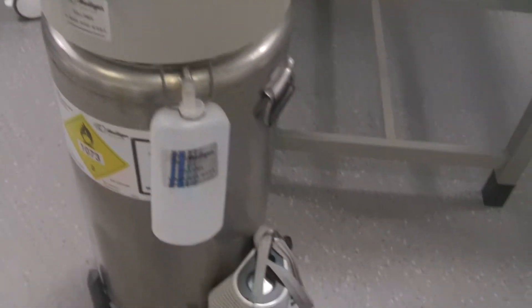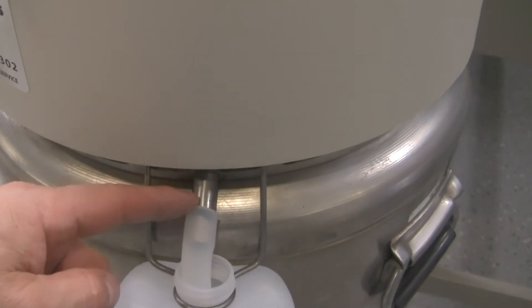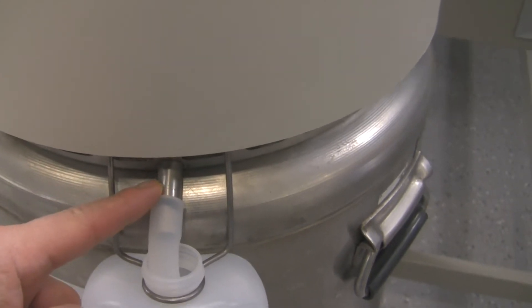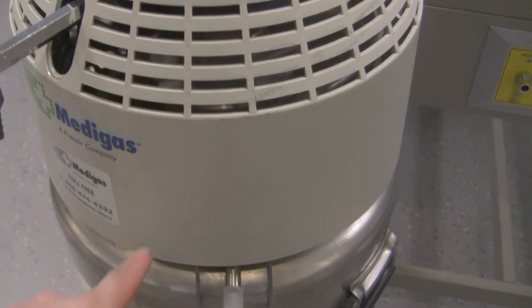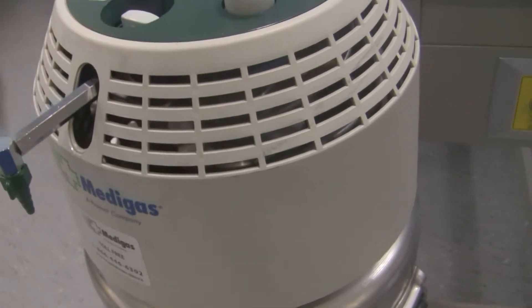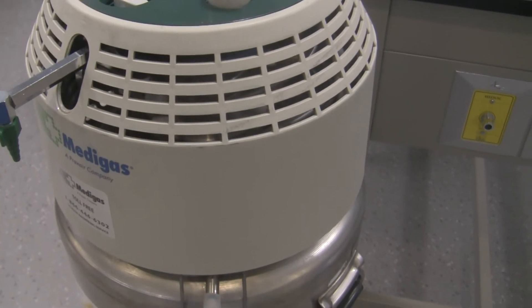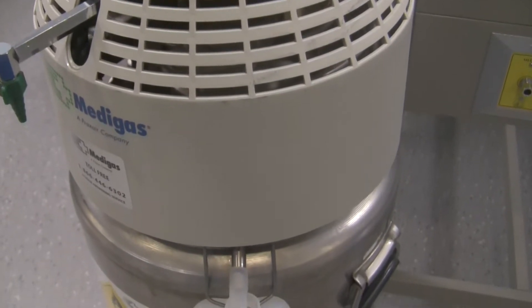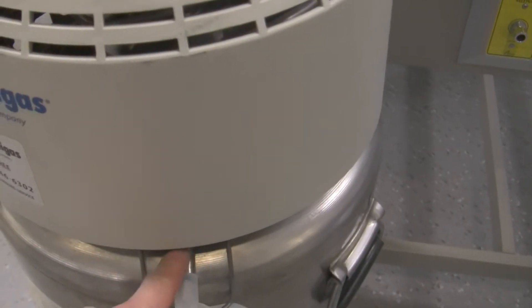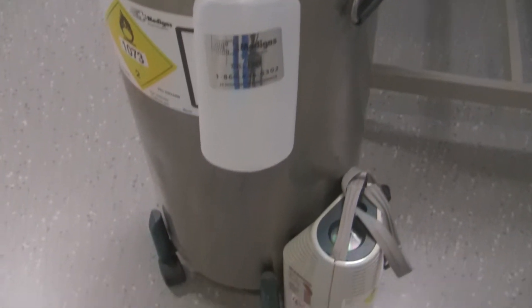The last couple of things on this reservoir: there's a metal valve or stem that sticks out from the container — this is a condensation collecting tube. Whenever the liquid comes out of the tank and converts to a gas, there are coils inside where that conversion takes place, and those coils get really, really cold — so cold that frost will develop. As that frost warms up, it starts to condensate, and all that condensation runs down to the bottom and comes out through this tube into the collection bottle. Without the collection bottle, water would accumulate on the floor and create a slipping hazard.